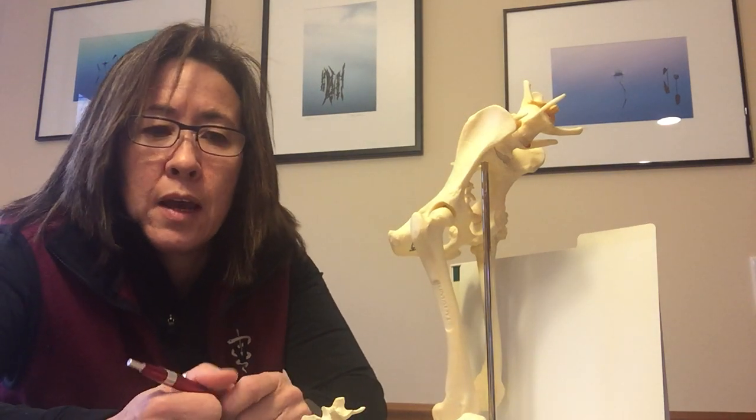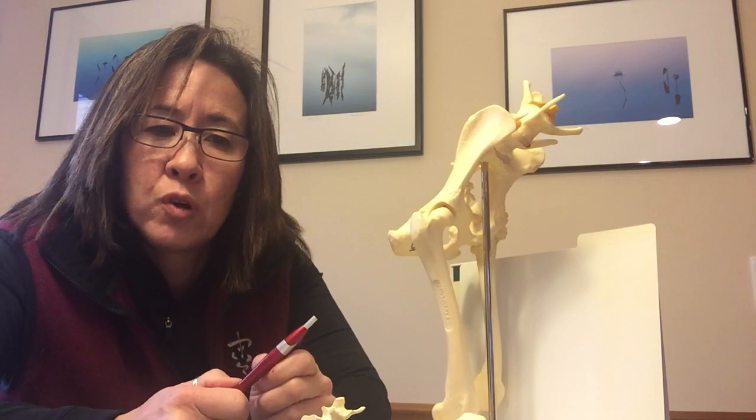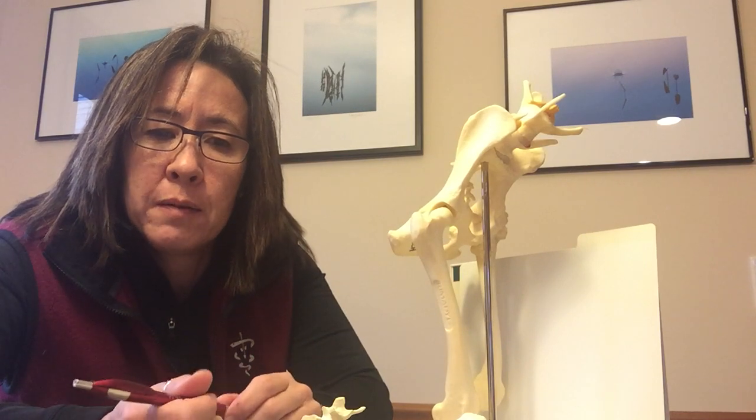I'm Mitch Powers and I'm here to talk to you about PennHIP. PennHIP is a set of x-rays that evaluates the hip joint for the amount of looseness, or what we'll call laxity. This laxity is the number one risk factor for a dog to develop hip dysplasia.